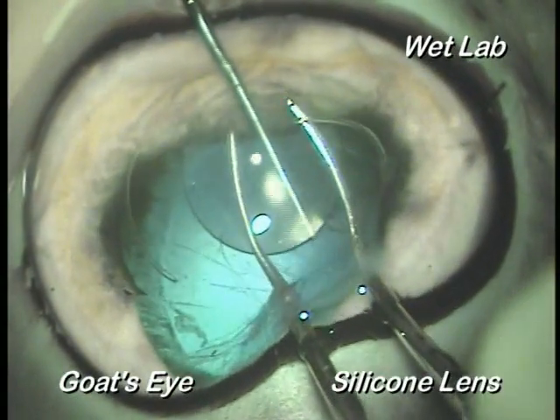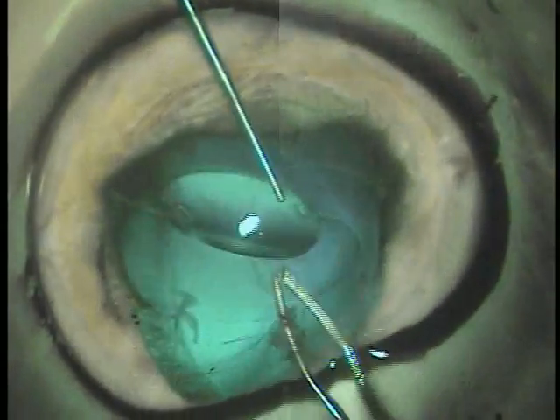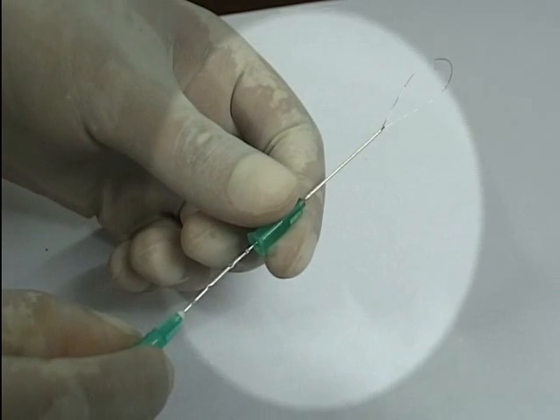Silicone lenses are difficult to refold or cut within the eye — they always tend to slip. We scratched our heads until we thought of this little wonderful device: the wire loop snare.